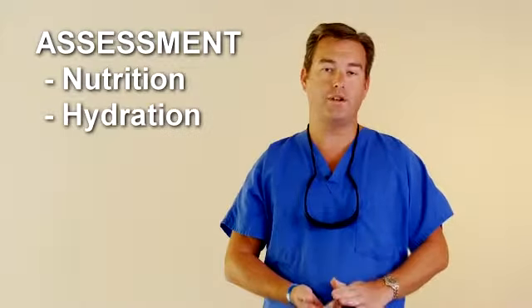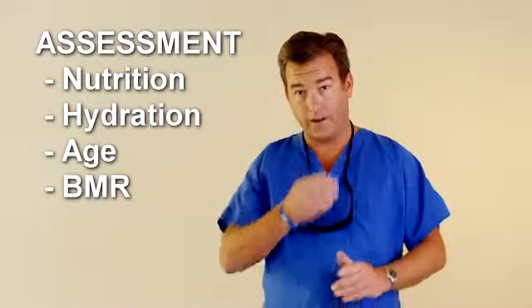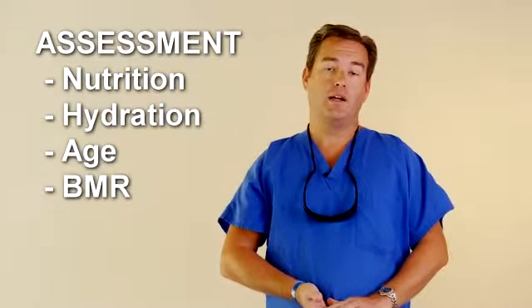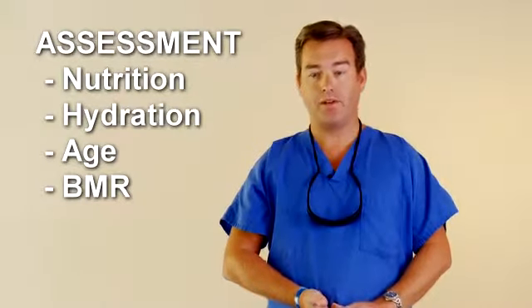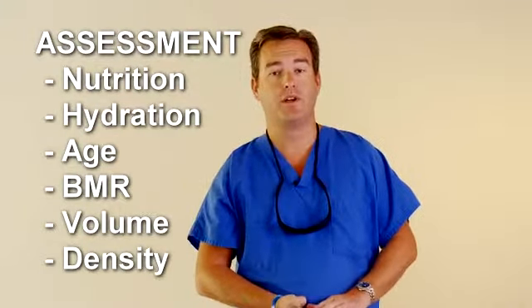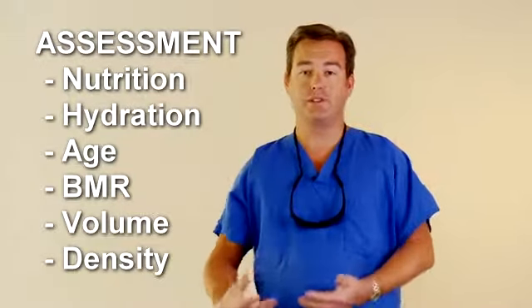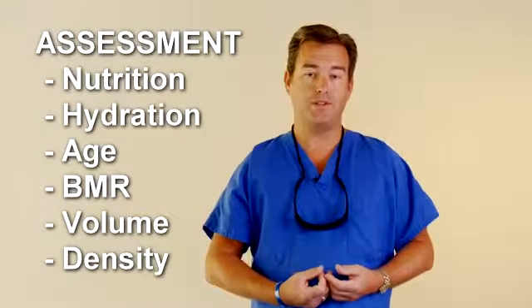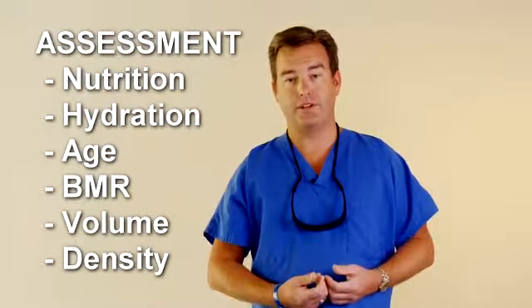So again, when you're assessing the patient, assess nutrition, hydration, age, metabolic rate. Obviously, a 1-year-old dog is going to heal a lot faster than a 12 or 14-year-old dog. You have to consider that and also the volume and the density of the area you're treating. If you're treating bone, it's going to go down a little bit less than if you're treating soft tissue. If the tissue is well hydrated, it's going to uptake the laser therapy a little better than an animal that's not hydrated. So depending on if you have those contraindications, you need to turn the power down probably a little bit for those treatments and maybe treat a few more times.